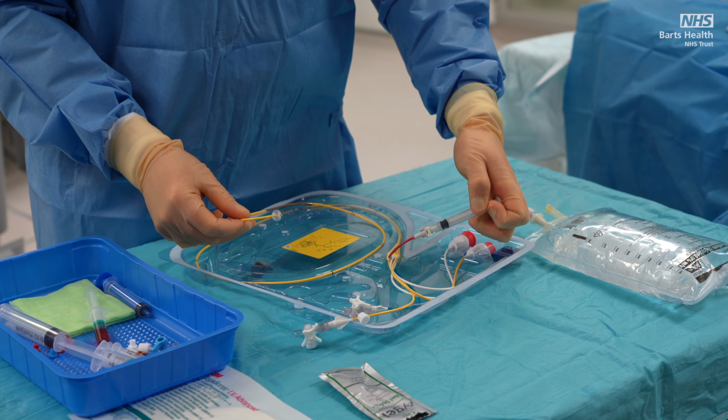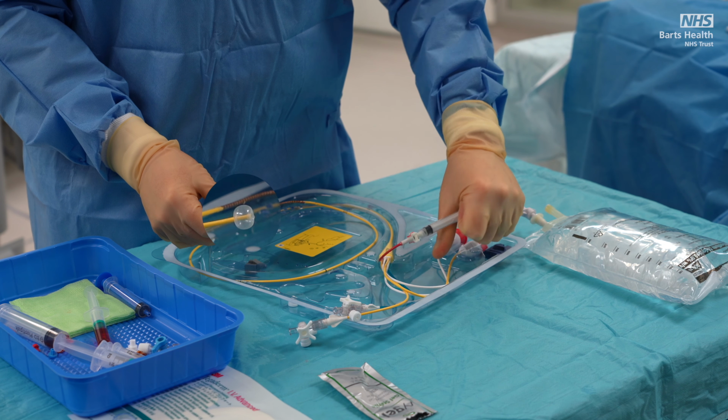This should be inflated to test the balloon integrity.